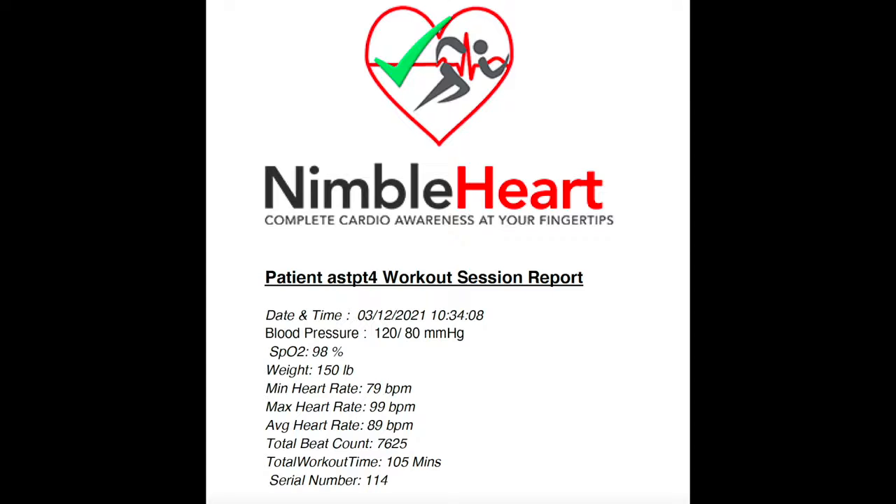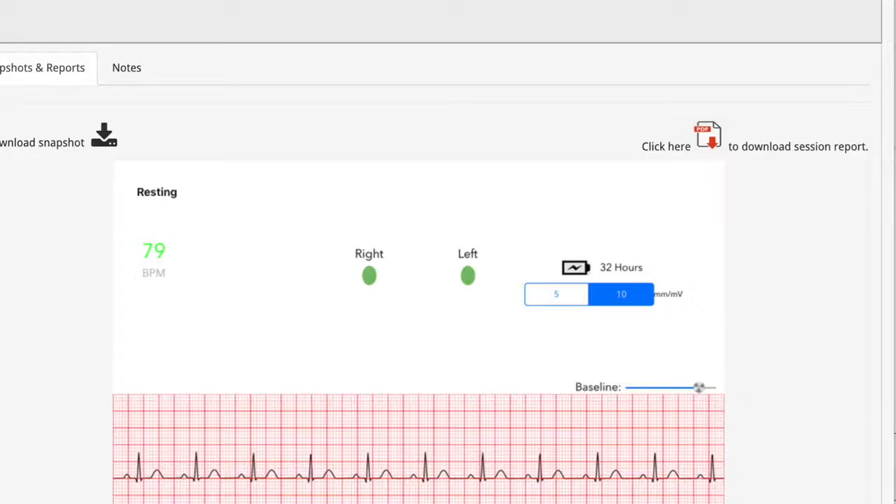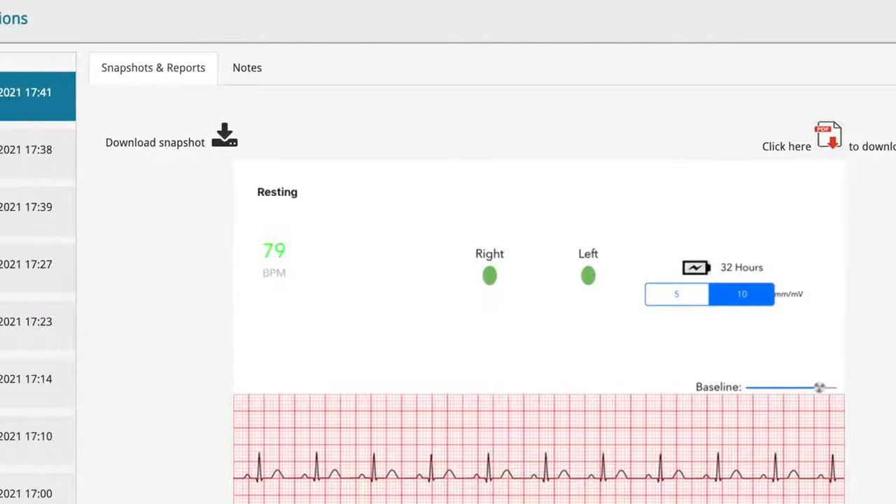In addition, the patients or the staff can take snapshots of the ECG traces any time during the session. The PDF report can be dragged and dropped easily into your EMR software.